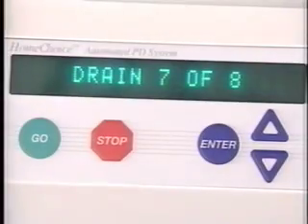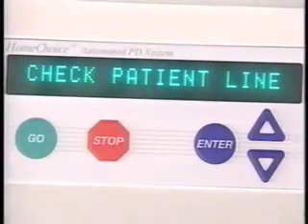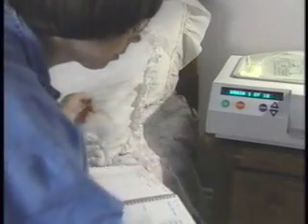The most common alarm is a check line alarm. The display may read check drain line, check fill line, check heater line, check patient line, or check supply line. For any of these alarms, the same process is followed. Check the line for kinks, closed clamps, fibrin blockage, or an empty bag, and correct it. When the problem is resolved, the machine will automatically restart.